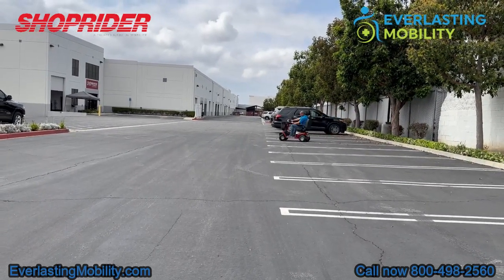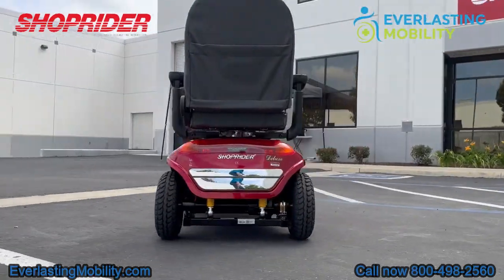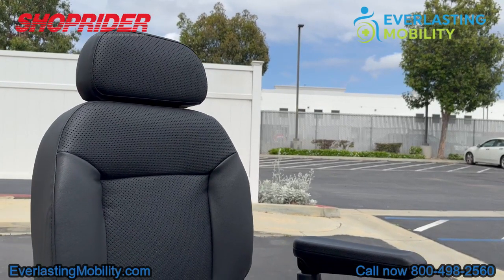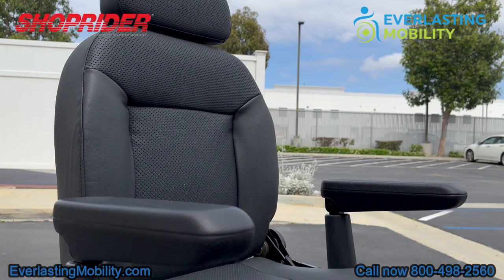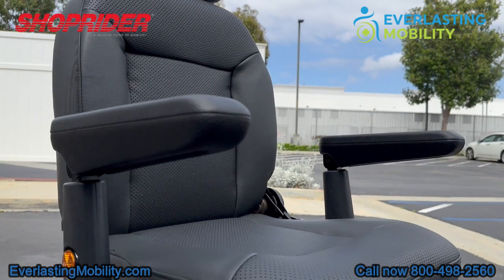A great feature of the Enduro is its high-back ultra-padded captain seat, which is great for users that are tall. I'm actually six foot four and I can fit in the scooter comfortably. So if you're a tall rider, the Enduro is a great choice.